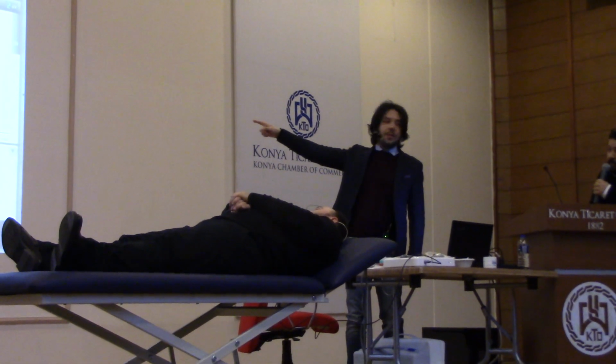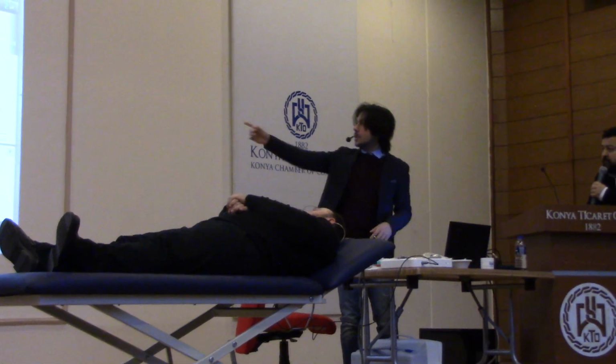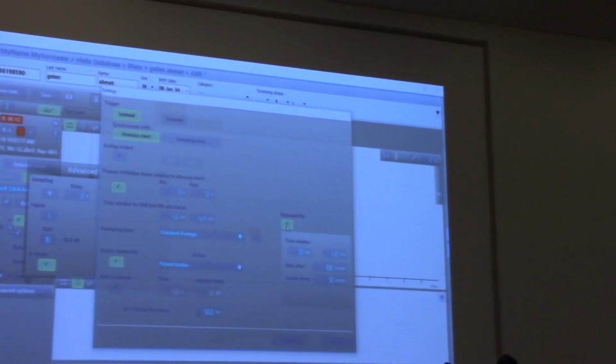Of course, you can define the range, the area of latencies from, in this case, 1 to 6 milliseconds, where the repeatability is calculated because, you know, in different intensities the signal displays, and also start after 100 sweeps.